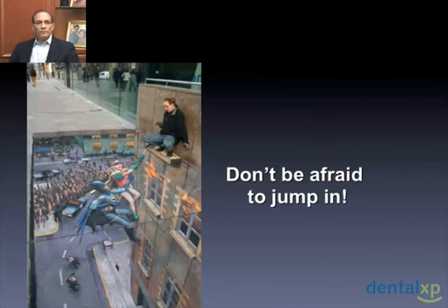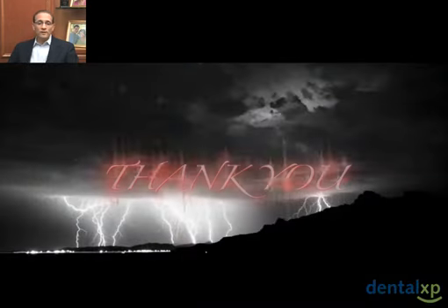If you don't think that you're comfortable to sit chair side and do a direct fabrication of a provisional or a custom impression coping, then use the indirect, the direct indirect type techniques where you can schedule the patient, take the impression, make the model, do all the model work ahead of time, contour the soft tissue model, create the provisional, and then come back to the mouth doing any final modifications that need to be done chairside in order for you to get the final restoration, the final aesthetics that you're looking for. So the main thing is just don't be afraid to move forward and try these techniques.